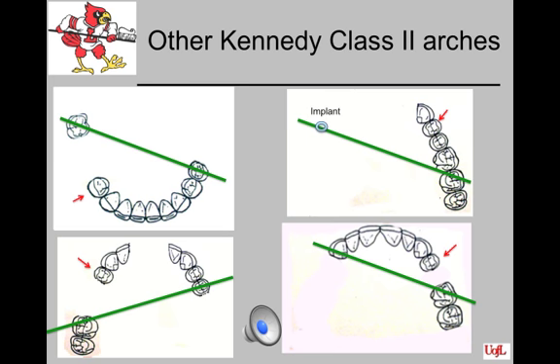This would have an abutment like a locator or an O-ring placed in it, and an attachment placed inside the final denture. The placement of an implant should be in line with the path of draw of the denture. Therefore, the bony contour of the arch must be considered when picking a site for the implant. A CT scan is helpful to make this decision.